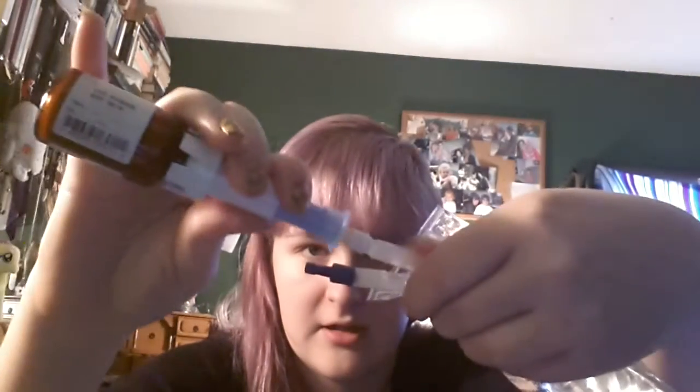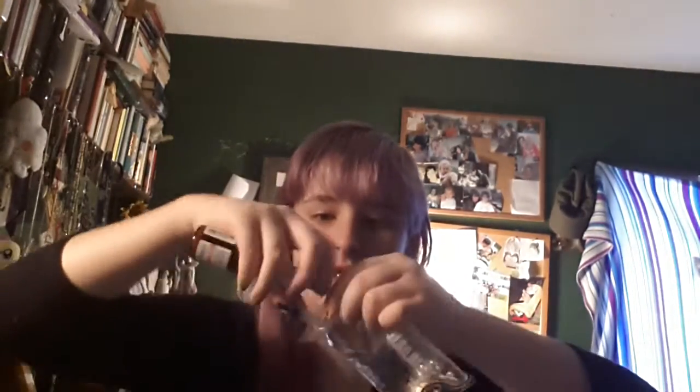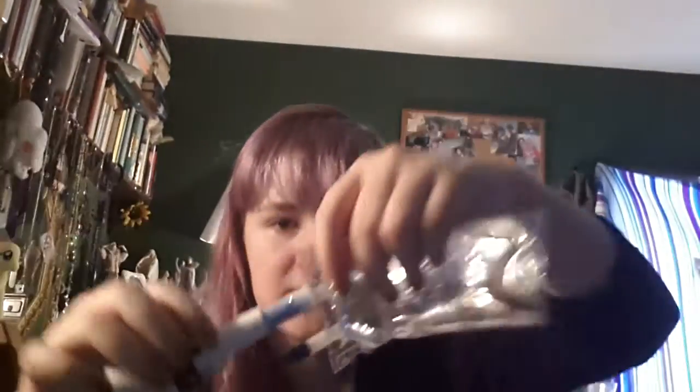I don't know if you can see it, but there's a needle inside of there. So you take this part here and shove it through — you'll hear a click or a pop at some point — like that. Then just shove it on in until it's flush with the saline bag, or whatever bag you're using.